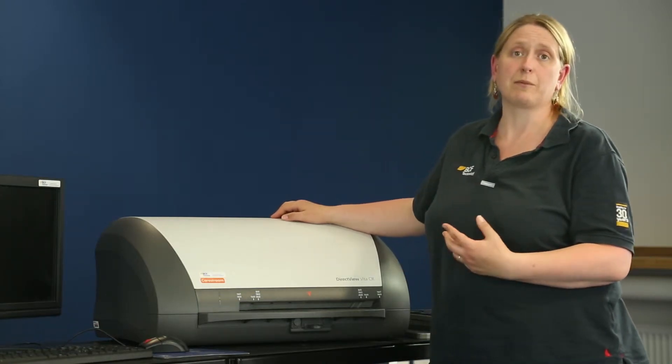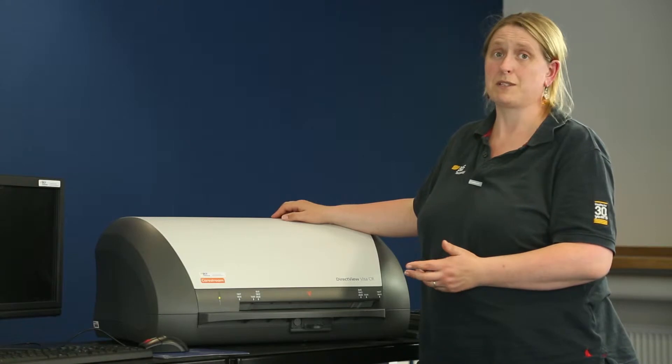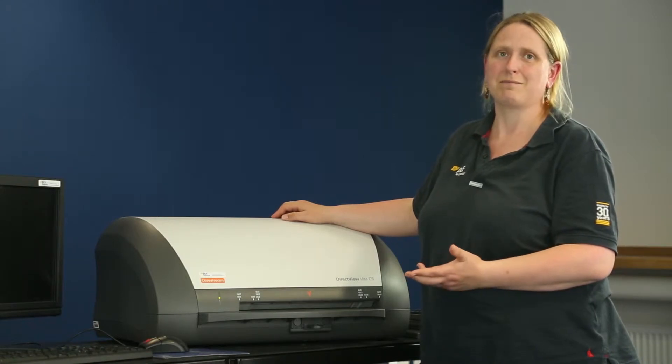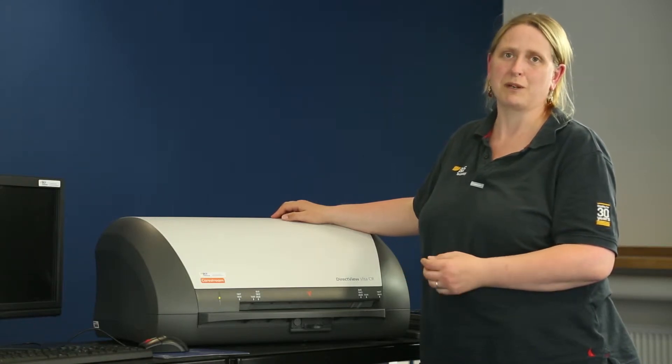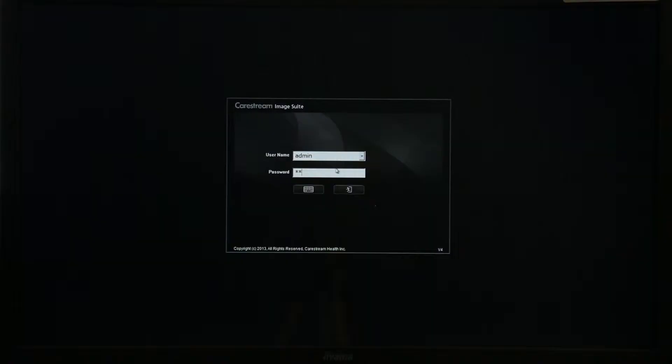The computer you can turn on either before or after the Vita, just by simply turning on the computer as you normally would. Now your system's booted up you can input the username and password that we've given you.